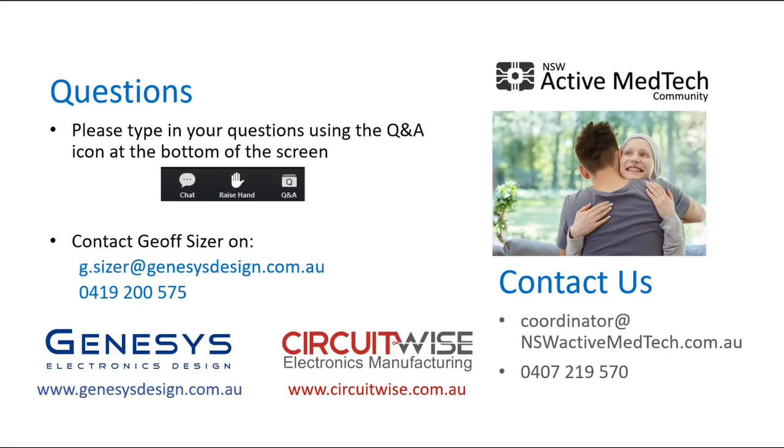Prior to that, you have to do the requirements capture and get all the stakeholders to sign that off. So it can be quite burdensome just getting everyone in agreement that the requirements meet the need. Then the other big chunk of work at the far end is the verification and validation testing. And I'm not talking about switching your circuit board on and making sure the LED flashes. I'm talking about absolutely intensively and rigorously testing every circuit module. Do the serial interfaces function with the appropriate clock and data rise and fall times? Are the logic levels correct? Are the functional aspects correct? Are the voltage supply rails correct? Can the voltages deliver the required current with some margin? Etc., etc., etc. So just a lot of detailed, rigorous work that simply takes time for the engineers to do.